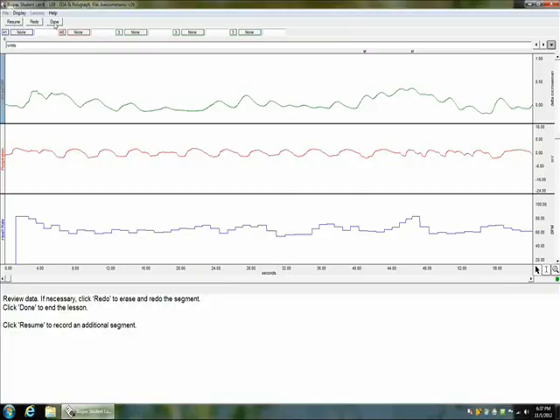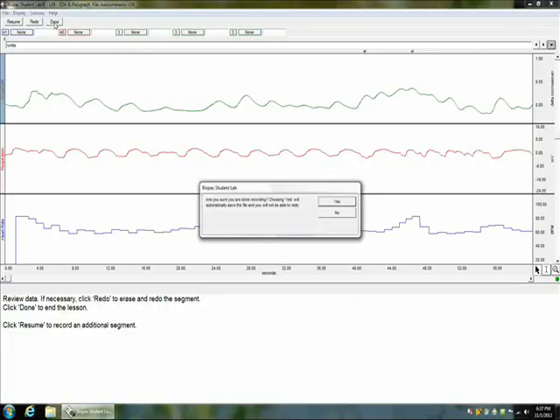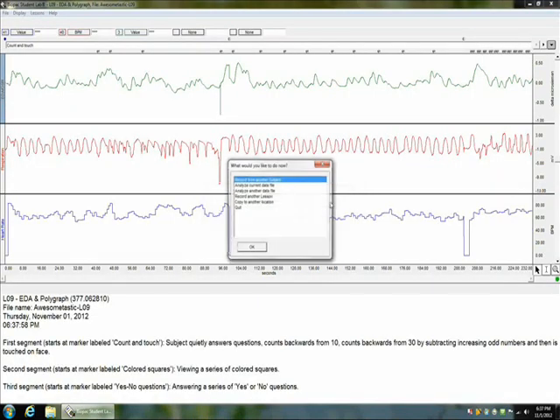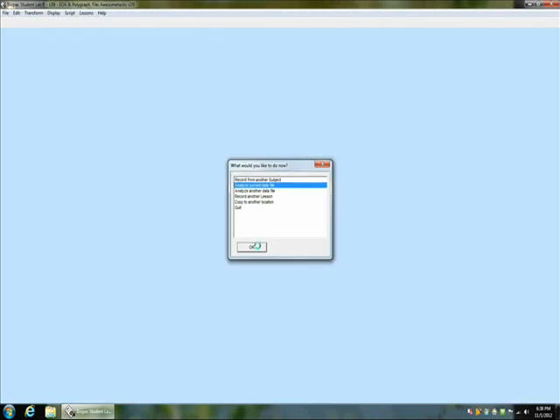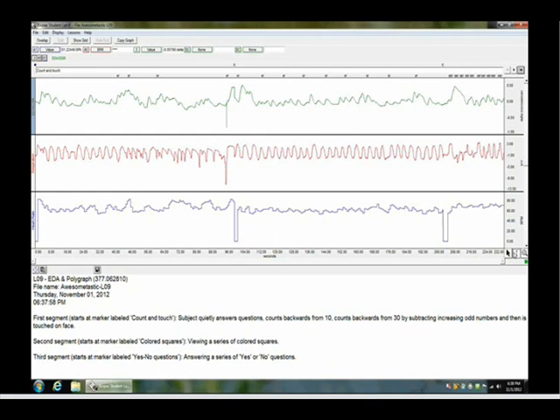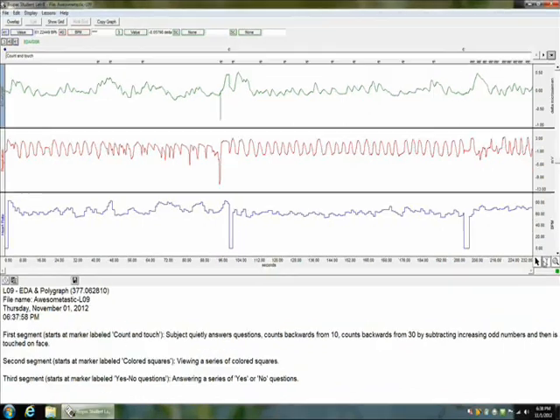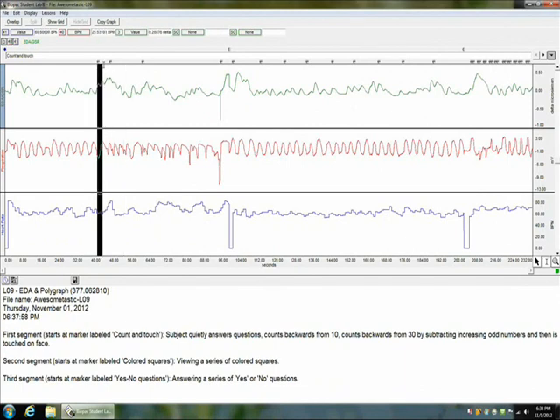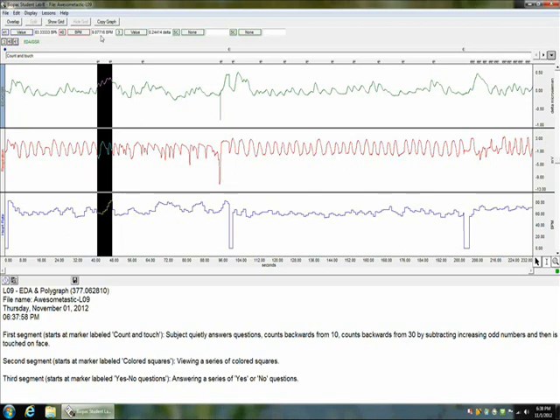So once we've collected all your data, we can move on to the data analysis. To do this, we're going to click done, then click yes, and then click analyze the current data file. Once we do all of that, our data will pop up condensed. Next we are going to select the eye tool at the bottom right of the data. This will allow us to select the data we want to get our values for. To do this, we are going to drag the cursor from the point at which the event we are interested in happened to the next event, like so. We can find our values for heart rate here, respiratory rate here, and EDA here.